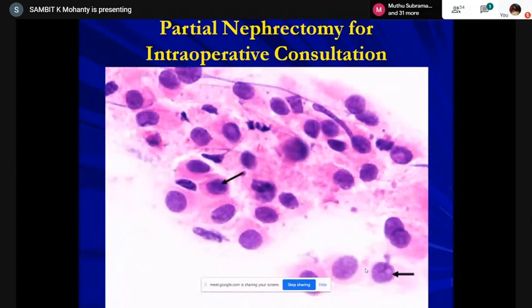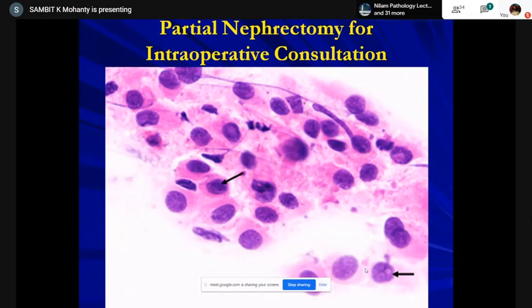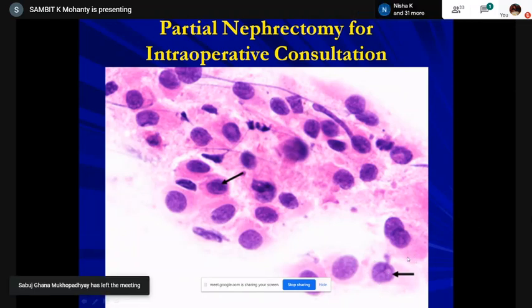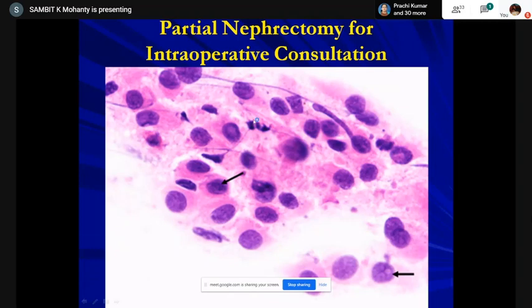The cells were round to polyhedral to polygonal with a little eccentricity, more or less round to eccentric nucleus, dense chromatin with some inclusions of a color similar to the cytoplasm — not a prominent nucleolus. There was a group visible.